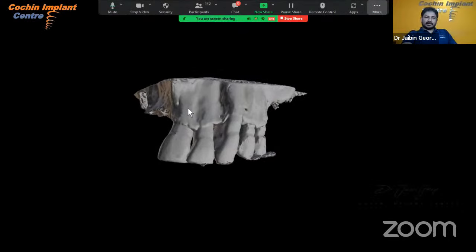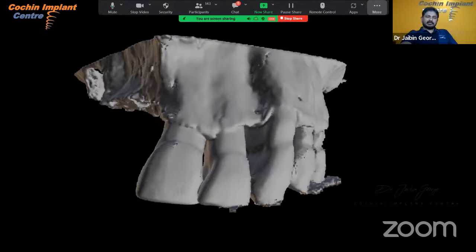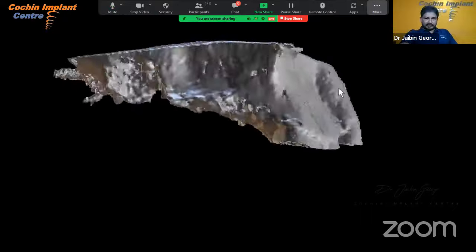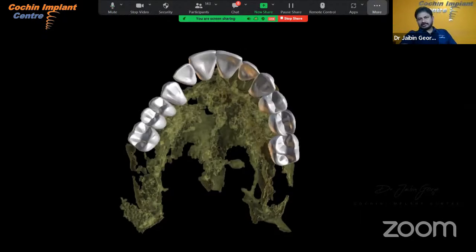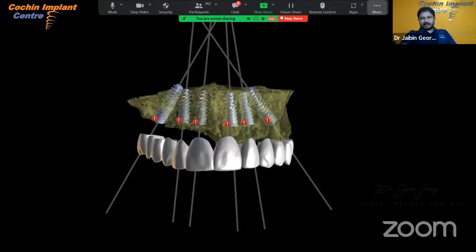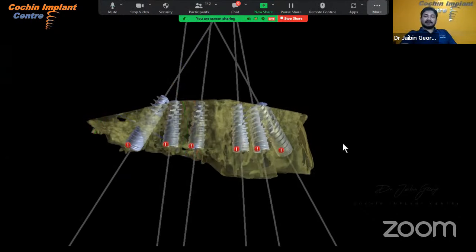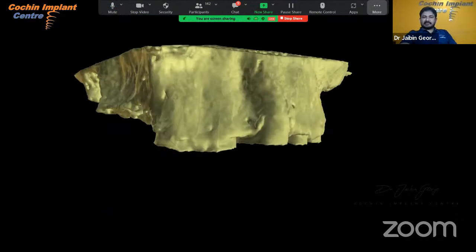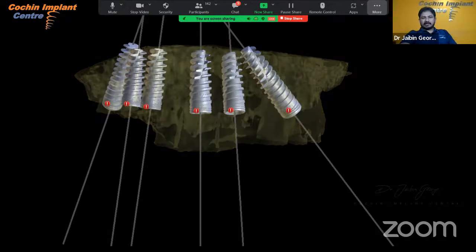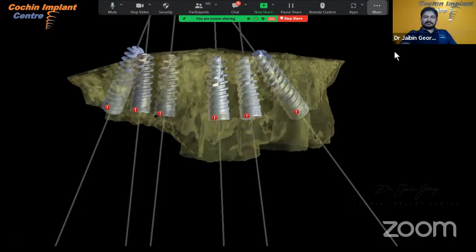Every case we do a virtual planning. This is the 3D rendered image of that case. We did virtual extractions, and then we started with the virtual planning. Almost every case we do virtual planning because we all know implant dentistry is a prosthetically driven entity. So first we plan the prosthesis. Accordingly, we place the implants. So this is the plan which we do. 6 implants. Distal implants were tilted and the center implants are straight.